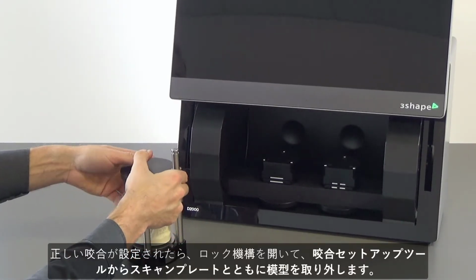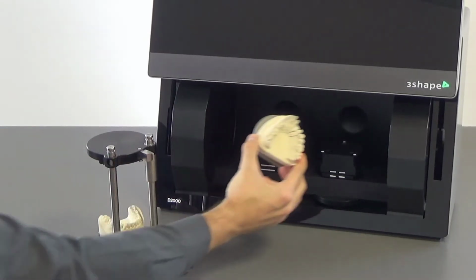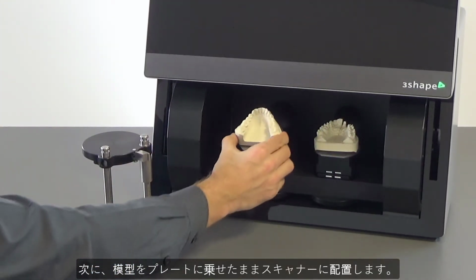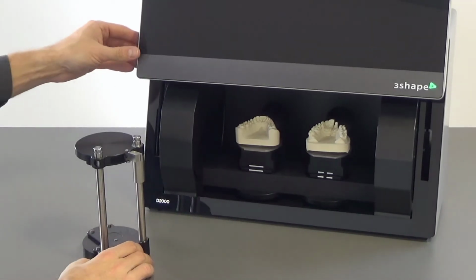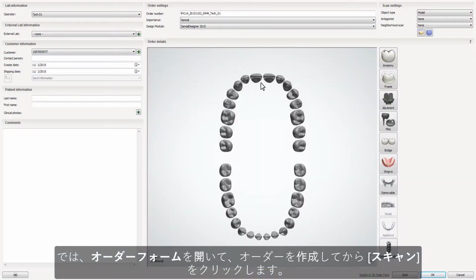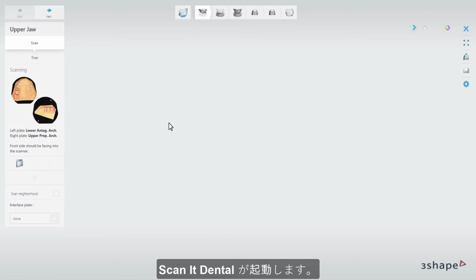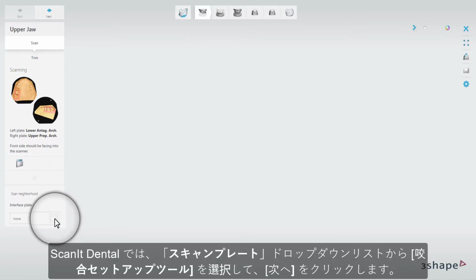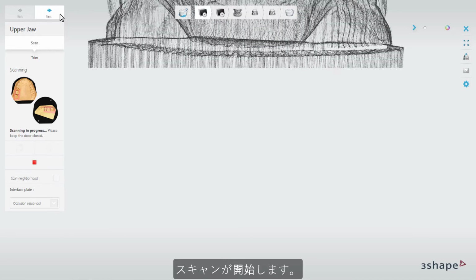Once the correct occlusion has been set, open the locking mechanism and remove the models along with the interface plates from the Occlusion Setup tool. Then insert the plates along with the models into the scanner. The upper model should be inserted on the right and lower model on the left. Now you can open a new order form and create the requested order and click Scan. The Scan It Dental software will open. In the Interface Plate drop-down menu, choose Occlusion Setup tool and click Next to start the scanning process.